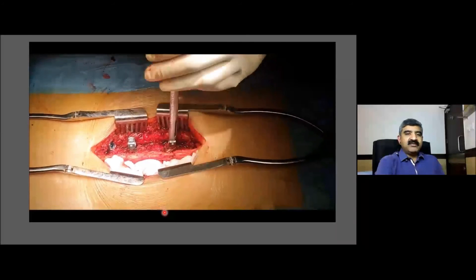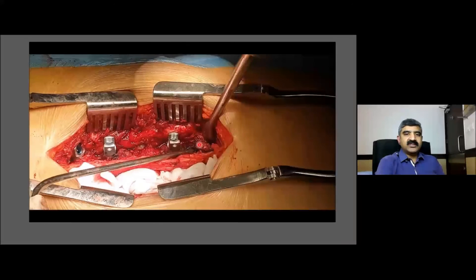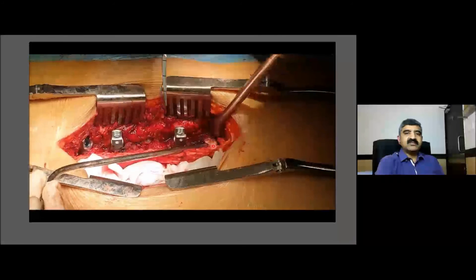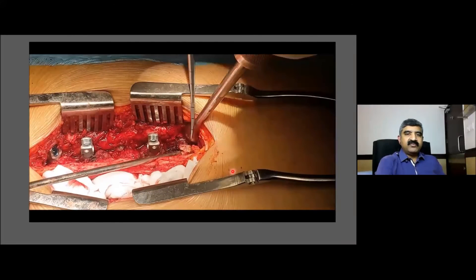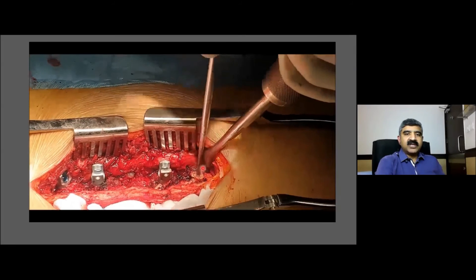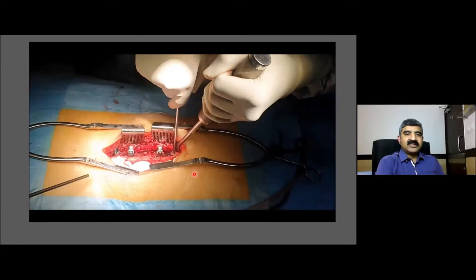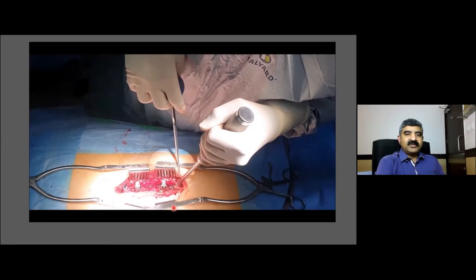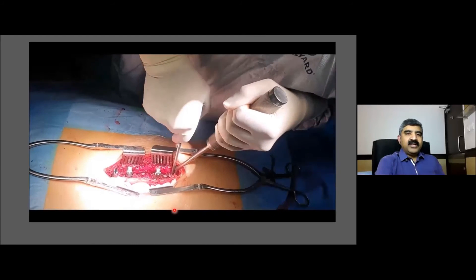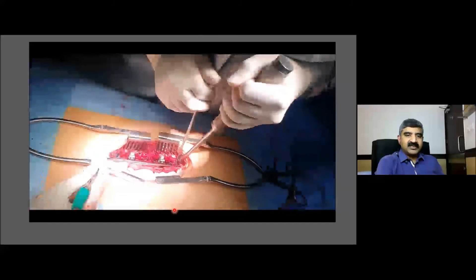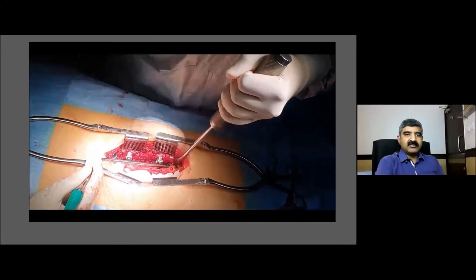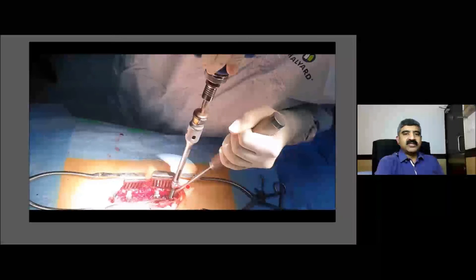Next I show D11, using the same maneuver. I use the nibbler to decorticate the outer cortex, see the cancellous blush, and use the gear shift with the convex side medially, inserting to the 20 mm mark. I then take it out, turn the probe with the concave side facing medially, go in again — do not push with too much force — find the soft spot, palpate with the ball-tip probe feeling the anterior stop, palpate all other walls, and insert the screw directly without tapping.